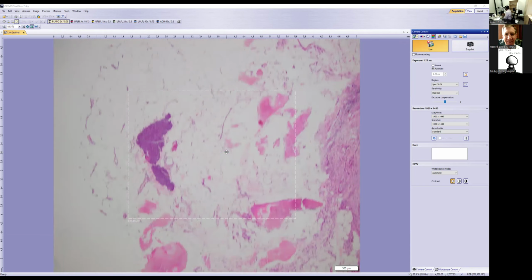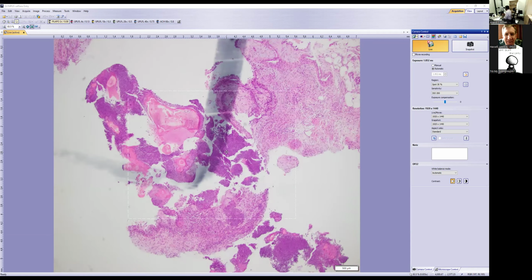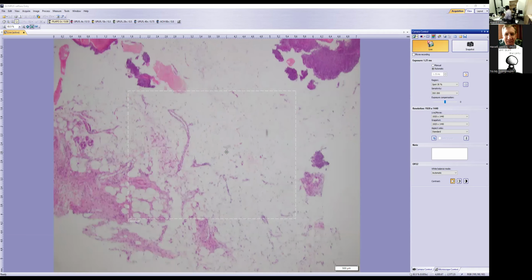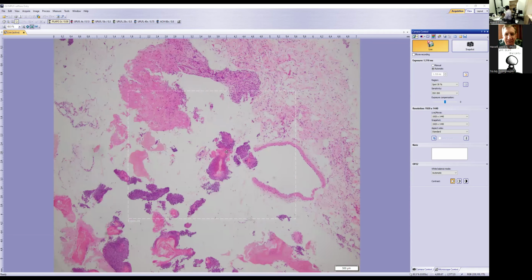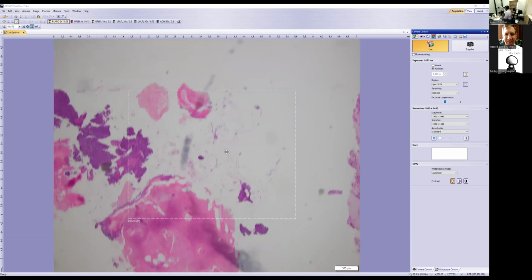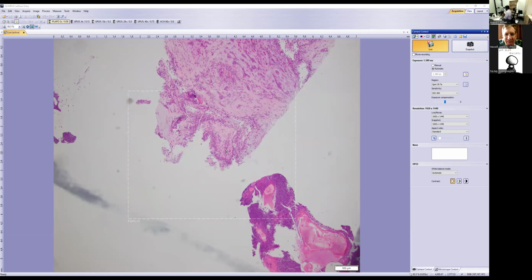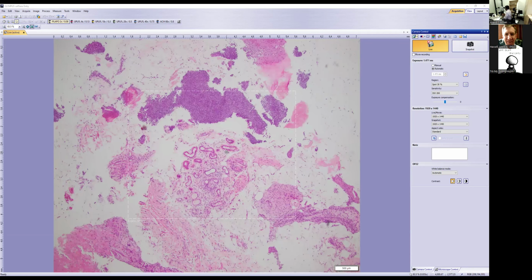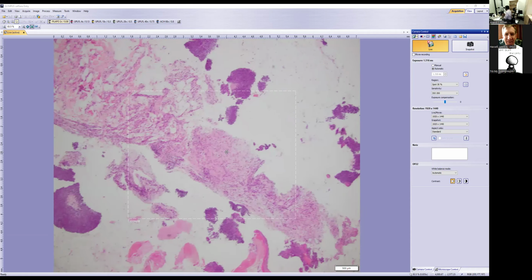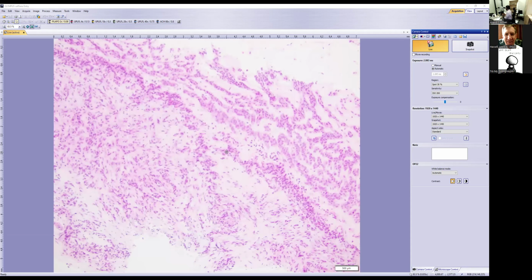There were two things that caught my eye in this. One was these obvious keratinizing squamous epithelium, and two was there was no breast tissue. It's pretty much fibroadipose tissue. So I was not sure what was going on, where the localization was. I asked them, is this under the dermis? Because I saw in this area there were some adnexal structures, but there was no epidermis in this biopsy either. So we have these fragments where, again, you can see these infiltrative appearing cells.